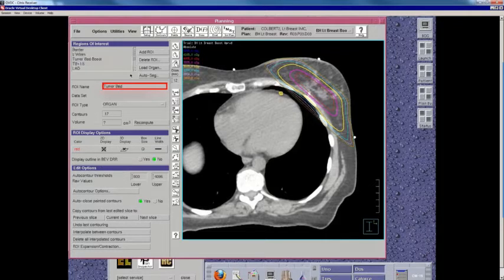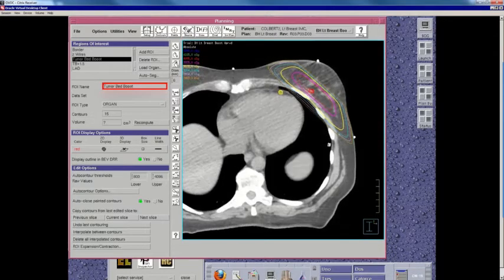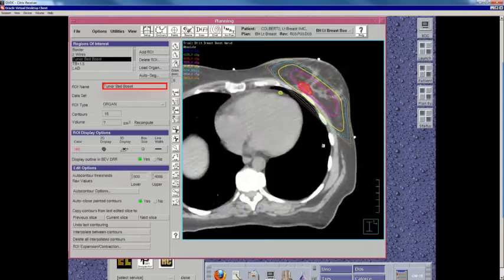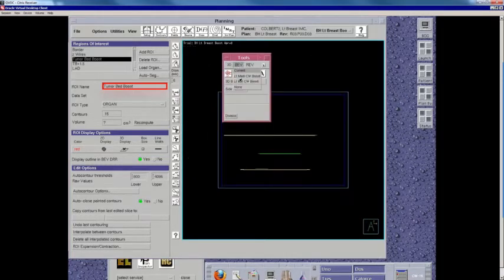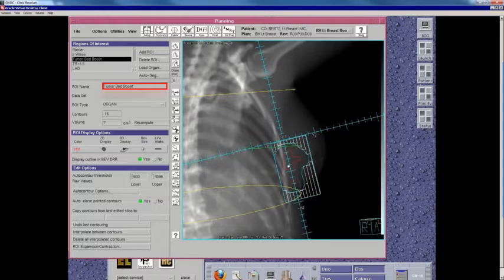Let me turn on that target. There's our little boost target. So I believe we just kept the same isocenter and just shrank the fields down and put a tight margin around the boost target. I can show you what one of those fields looked like. There you go. So yeah, we kept the same tangent isocenter and just put about a 1.3-ish centimeter margin from what we thought was our boost target to block edge. Very reasonable approach in a patient like this. If we had tried to use electrons, we could have come up with an electron energy that would have covered this target, but it would have been so high that a lot of the electrons would have streamed into the lung and heart, and it would have increased the LAD dose, whereas with this approach, we have no LAD dose.